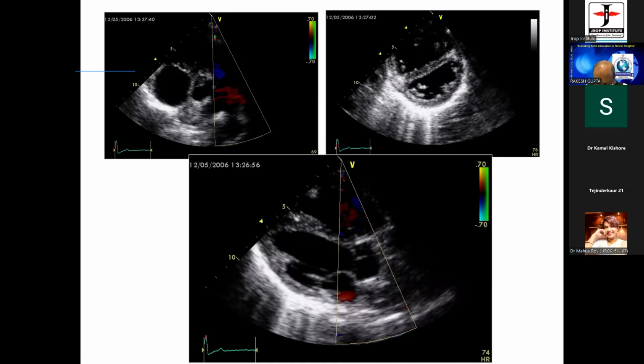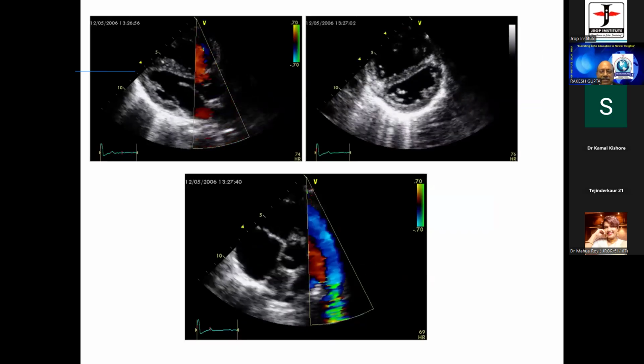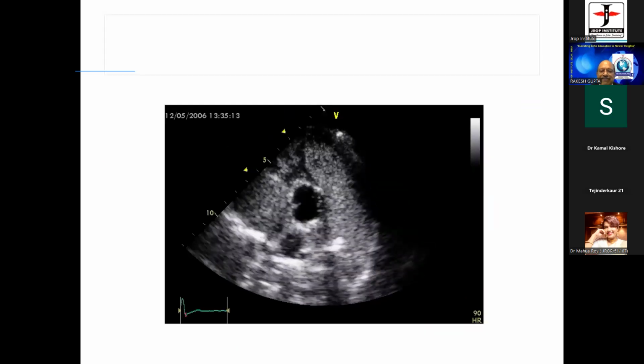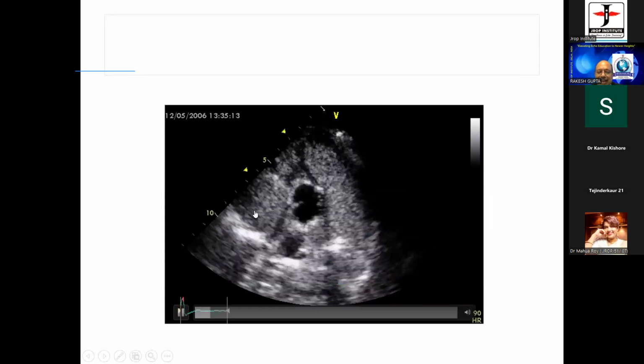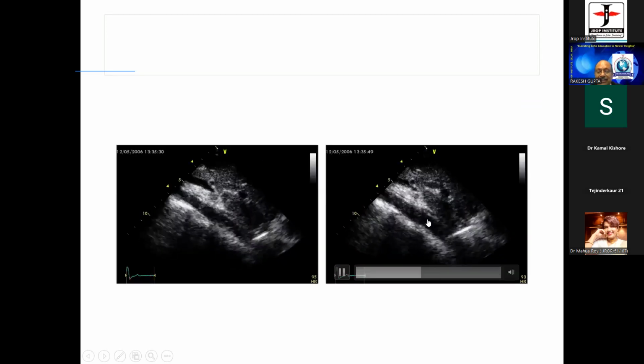And measuring the pressures. Now, I want to say echocardiographically, what we do in our lab a number of times, and we did the same thing: I gave an agitated saline contrast. It will come and opacify the RV and RA. Now it will go from the pulmonary artery to the descending aorta. And where do you see the descending aorta? In the abdomen. Yes, the contrast was seen in the abdomen.